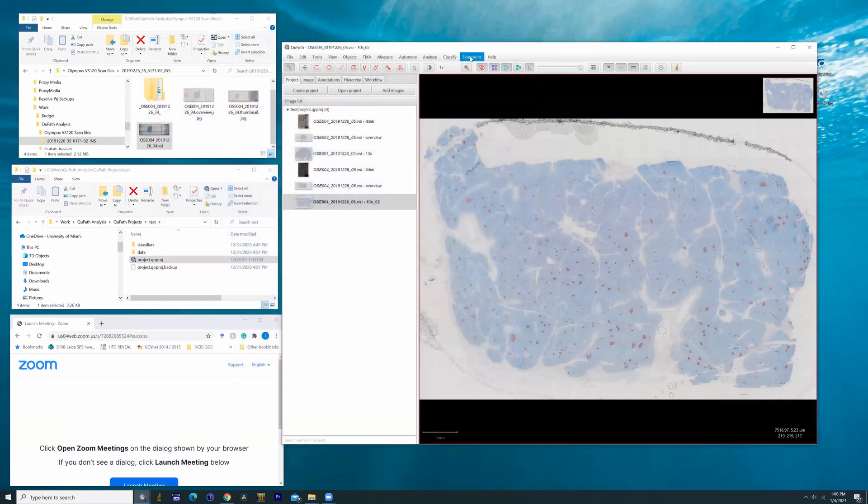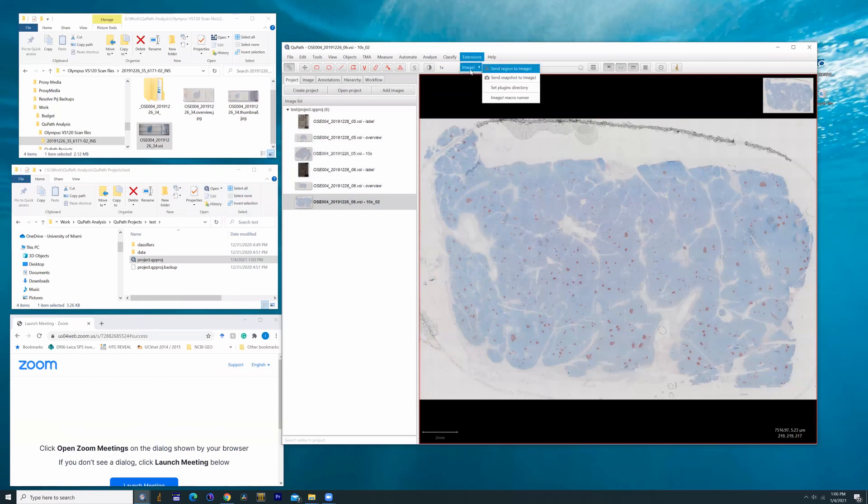What I actually want to do today is, more importantly, export it into ImageJ so we can actually use the internal software of ImageJ for analysis.